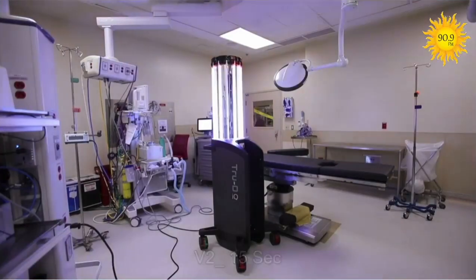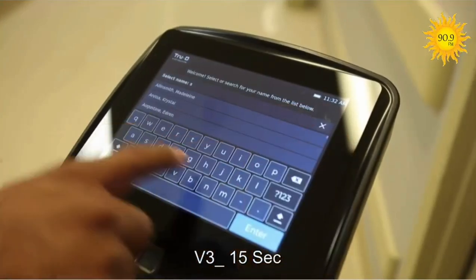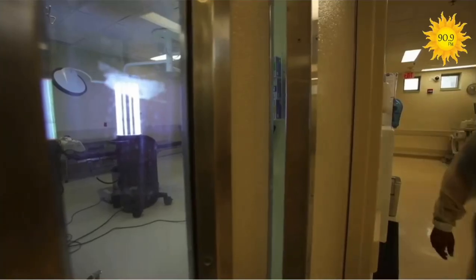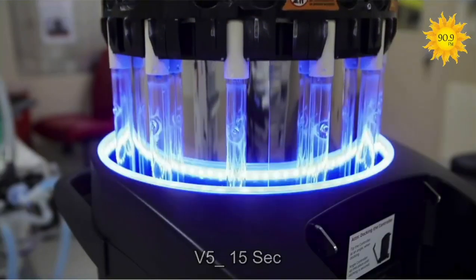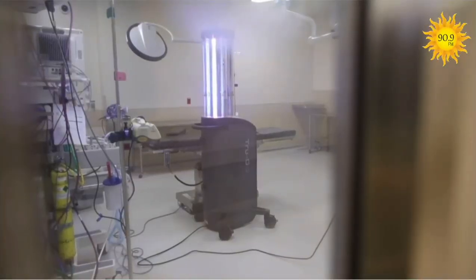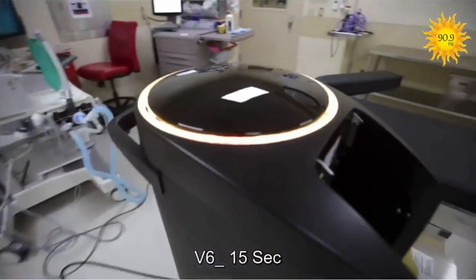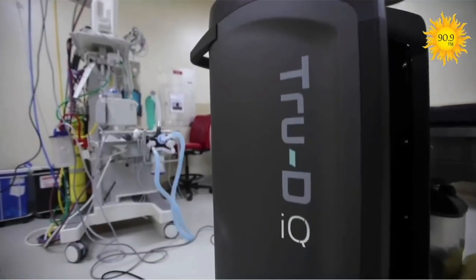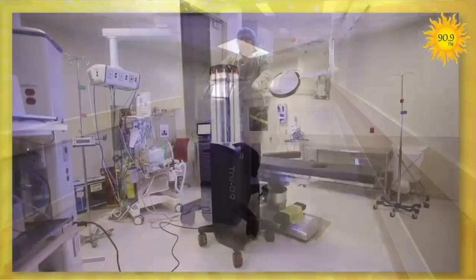Right, and I guess the other thing that I'm noticing from the videos and some of the photos is it's in the room by itself. Because of that ultraviolet light, a human can't really be in there while it's working. Right. It does it on its own. Right, it's unsafe. So there's a remote control that you take off the machine and you lock the whole room down, and then you turn it on. It doesn't penetrate through glass. Right. So you're able to see it if you would like, but in rooms that do have glass doors, we do close the curtain, just because I think it makes people uneasy.